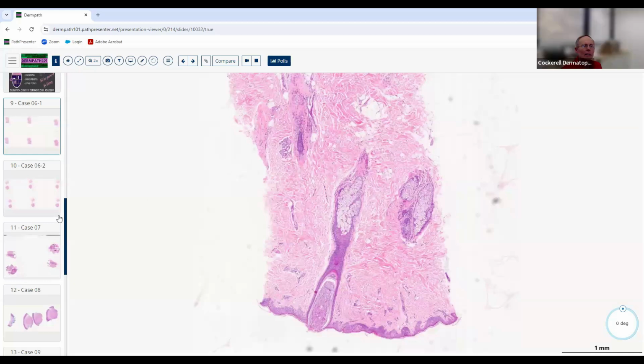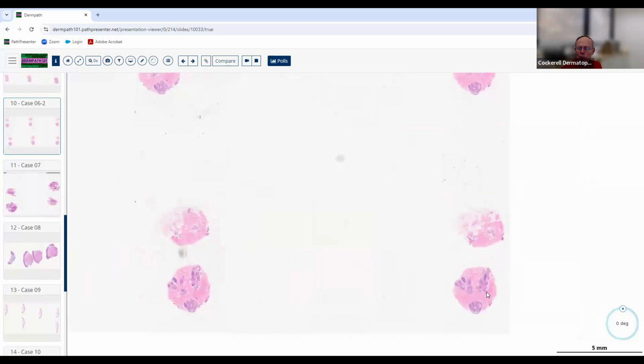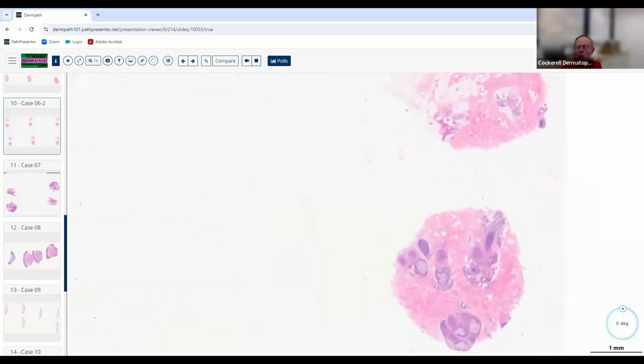Alopecia areata. Good, excellent. There's nothing else in dermatopathology that will give you synchronization of all of the follicles like this other than AA. So when everything gets hit, and especially if you see multiple follicles in catagen at the same time, that really doesn't happen in anything other than that. Even in patients taking chemotherapy, they don't hit all their follicles. Their hair becomes a diffuse alopecia, but it doesn't get every single hair follicle. They still have some hair there.